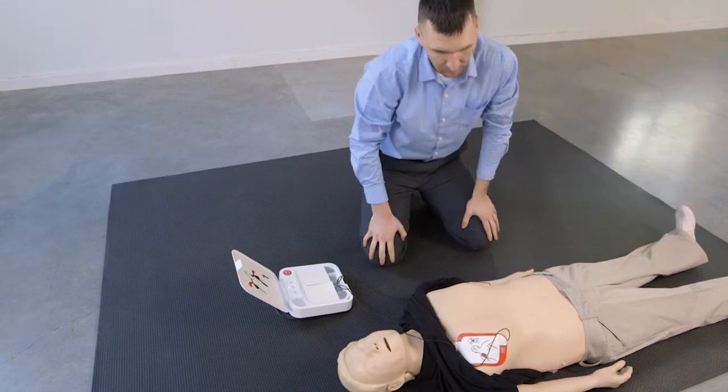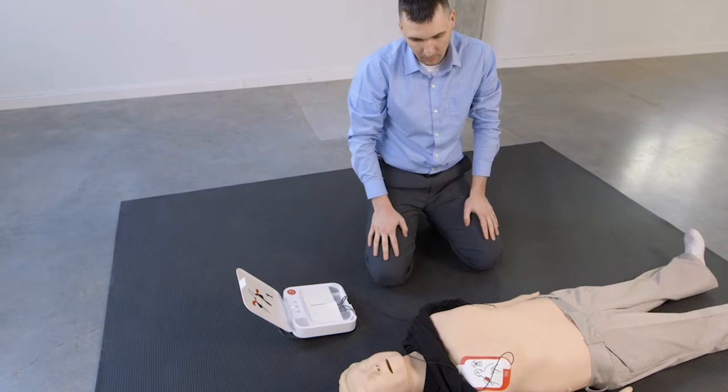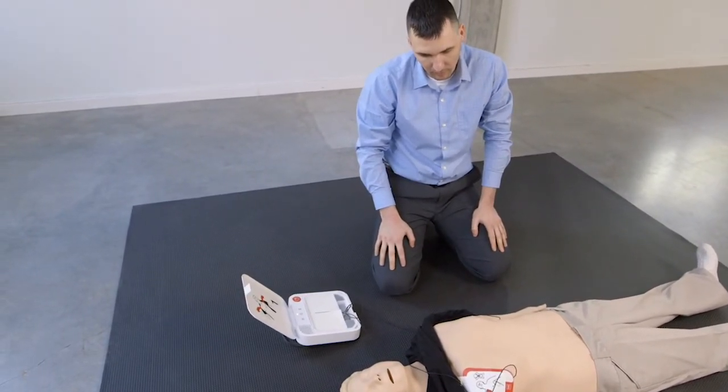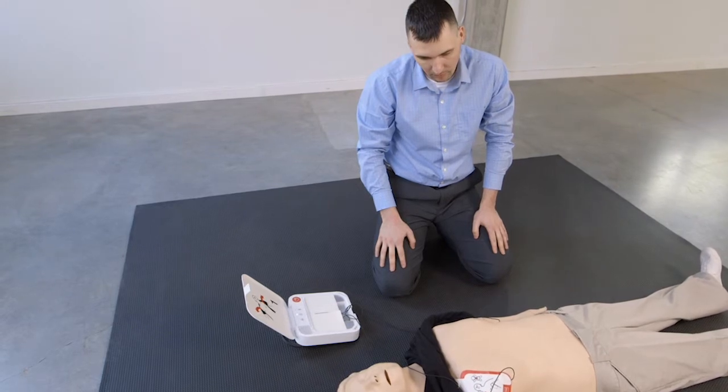Do not touch patient. Analyzing heart rhythm.